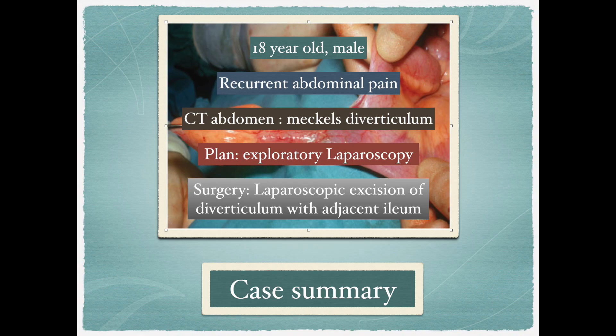This was an 18-year-old male with recurrent abdominal pain. CT abdomen showed Meckel's diverticulum. A diagnostic laparoscopy was planned, and we decided to perform a laparoscopic ileal resection in this patient.